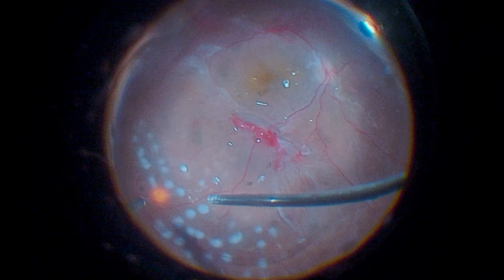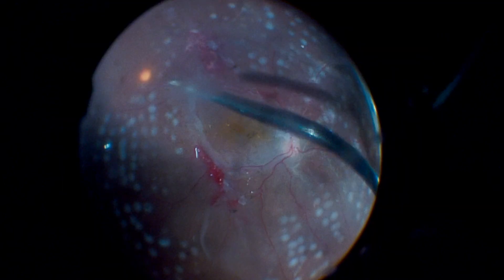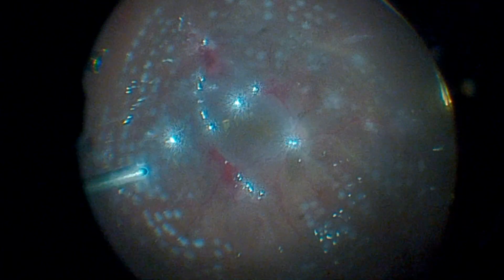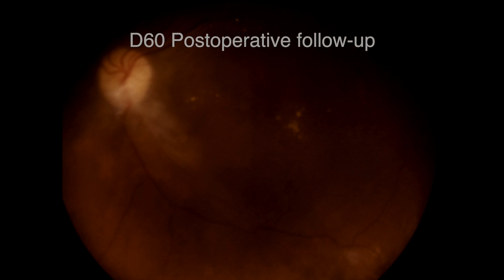Panretinal photocoagulation is then performed with the endolaser probe under perfluorocarbon. A fluid-air exchange is done, and laser treatment is applied to the entire peripheral retina. At the end of the surgery, silicone oil is injected. A good anatomical result can be observed in the late postoperative period.